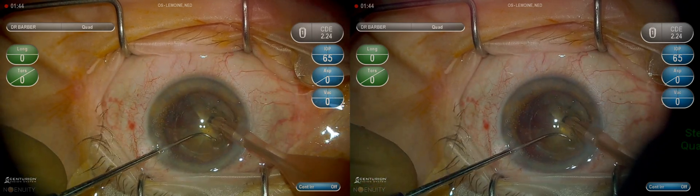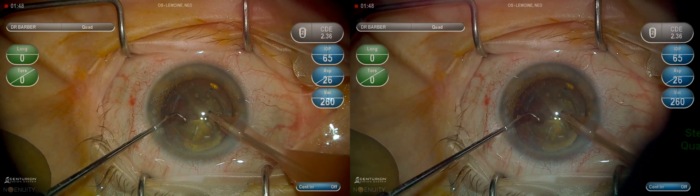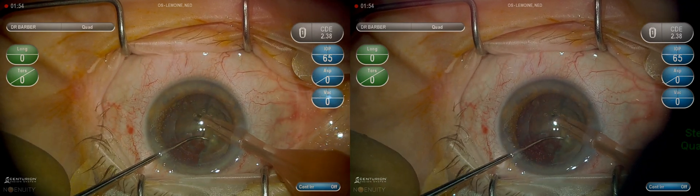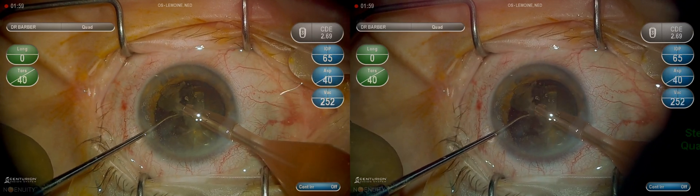I have found this to be very safe. Rotating the nucleus so that the fragment I am aiming to remove is directly across from my phaco needle and bringing it to the central safety zone at the iris plane.